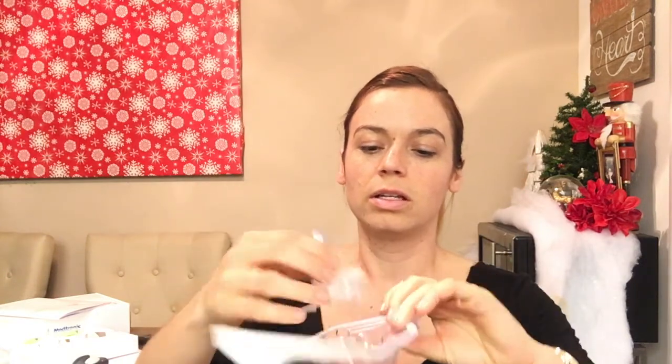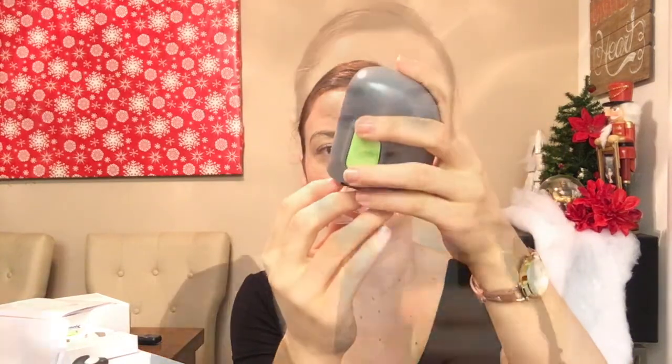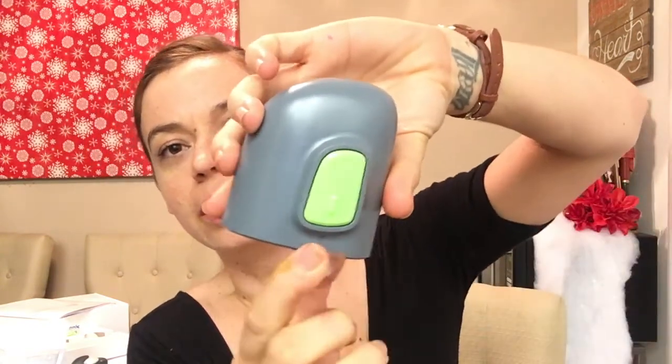Let's go ahead and open up — yes, here is the device. This is a needle. I'm gonna go ahead and put it in the inserter. Make sure you hold the sides because this is what's gonna release the needle and you don't want to hurt yourself. Go ahead and slowly take that off.